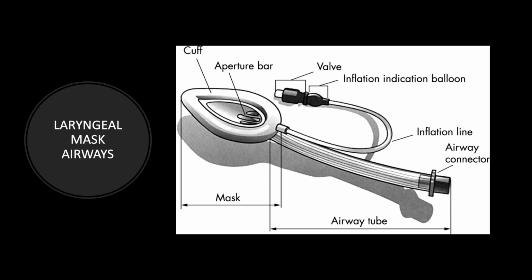Next, going on to supraglottic devices. In general, there are two big umbrella categories. There are the supraglottic devices, which are LMAs and iGels, which are kind of the newer generation. And then secondly, there are retroglottic devices, such as the Combitube and King LT. We'll have all of these different types of supraglottic devices available at our airway day, so we can practice with each device. Every center and EMS service will stock different supraglottic devices, so again, just become comfortable with whatever is stocked in your emergency department.